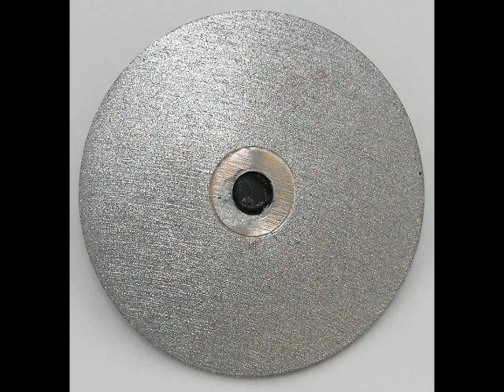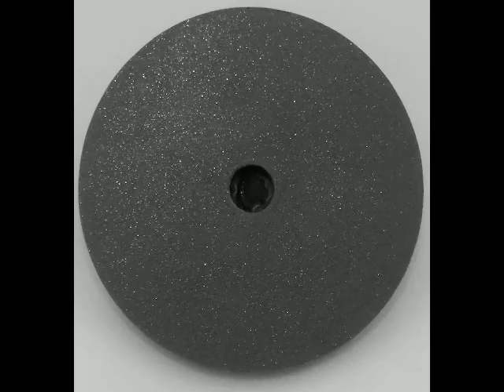What you see on the screen is the diamond disc. We use this disc to sharpen extremely dull or damaged instruments. Next, we have the carbide rubber disc. We use this disc to maintain an edge, taking off the minimum amount of metal necessary to maintain that sharp edge, making sure that we do not have to replace the instrument sooner than needed.